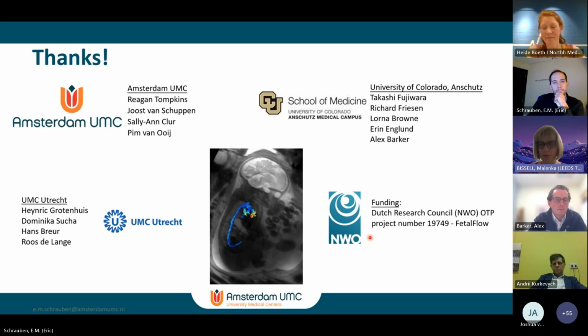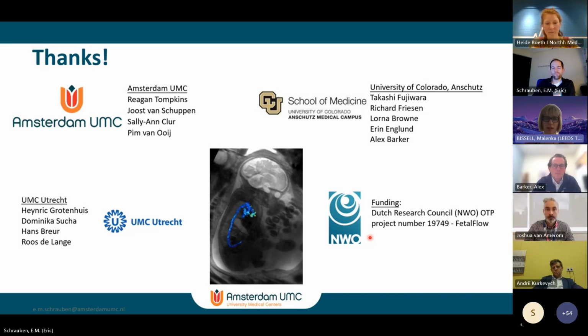That is fantastic work, Eric. Really impressive pictures. My first question is, do you scan at 1.5 or do you scan at 3 Tesla? Yeah, we scan at 3 Tesla. Have you ever tried it at 1.5, or is it just a no-go? If we had a 1.5 Tesla research scanner, we would be trying that, yes. I would prefer to do it at 1.5 Tesla.